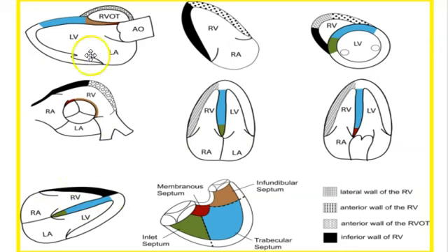So there are different nomenclatures for the right ventricle too. We're paying more attention to the right ventricle these days, but in a lot of labs, they're still not paying much attention to it. I can tell you this, in stress echo, the right ventricle isn't even considered. We'll talk about that later, but for the most part, stress echo is all about the left ventricle. But for test purposes, we should know these walls, okay?